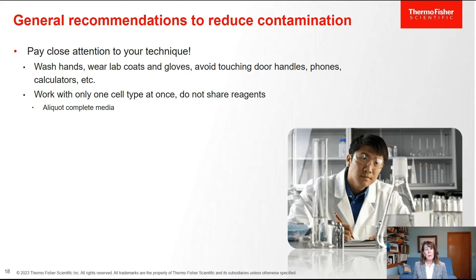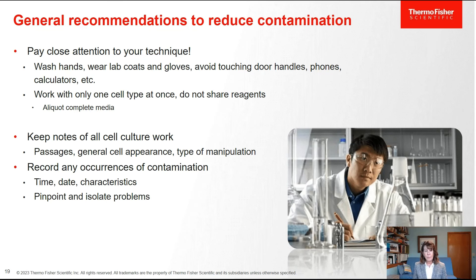Here are ways to reduce the chances of contamination. Number one: pay close attention to your technique — do all of the things you know you're supposed to do. Use proper aseptic technique. Wash your hands when you go into the lab. Wear lab coats and gloves. Don't answer texts while working in the hood; if you must, put on fresh gloves before returning to the BSC. Work with only one cell type at a time. Don't share reagents across different technicians or cell types. Aliquot your complete medium so one aliquot is used per cell type.